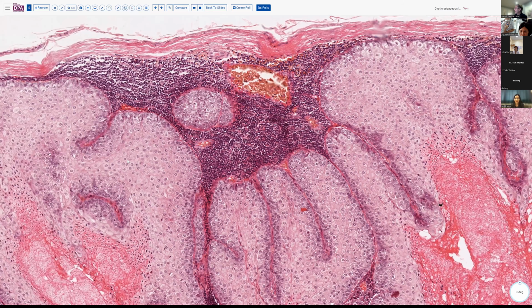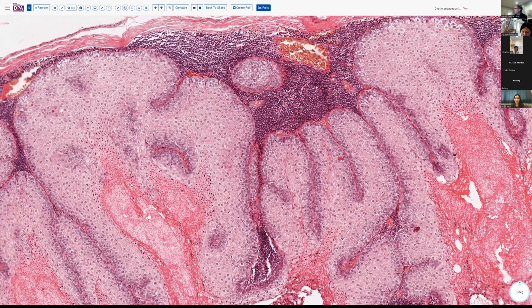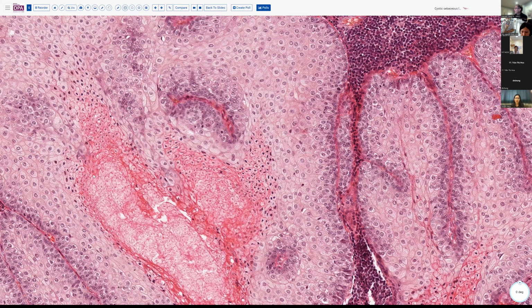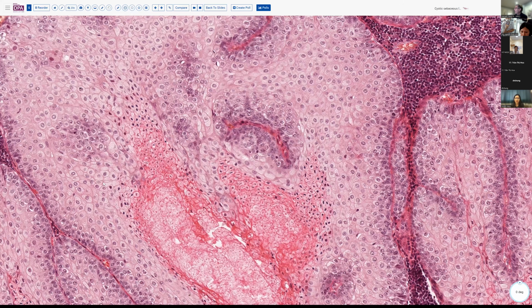So if you don't call it sebaceous and think that this is more squamoid, that's not a big problem. But as you can see, it's sort of making a sebaceous type of secretion here. It's not making the usual keratinized squamous epithelial secretion. It's this more foamy type of pattern. So it's a bit of a challenging call in some respects, but I think you can see there's a degree of this sort of central foamy type change, even though many of the cells have sharp cell borders.